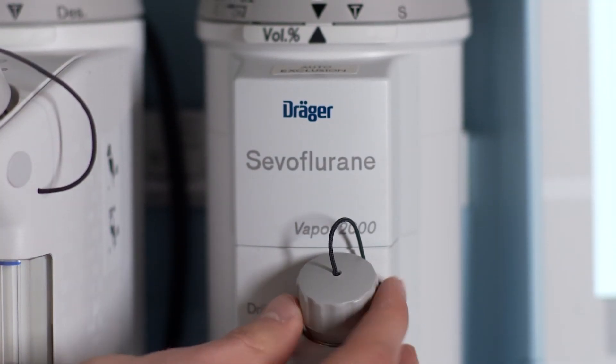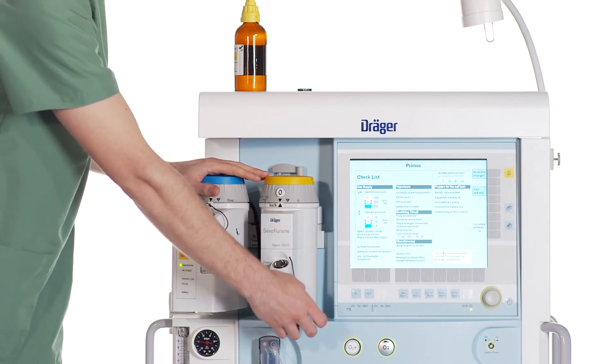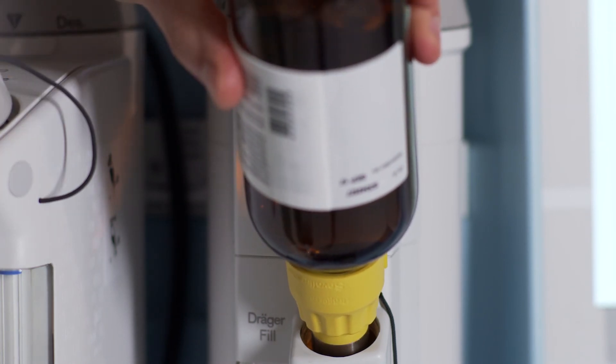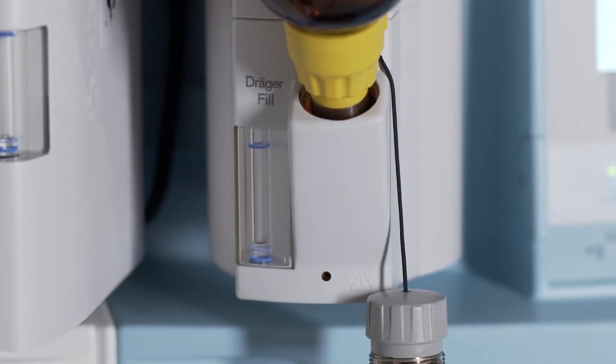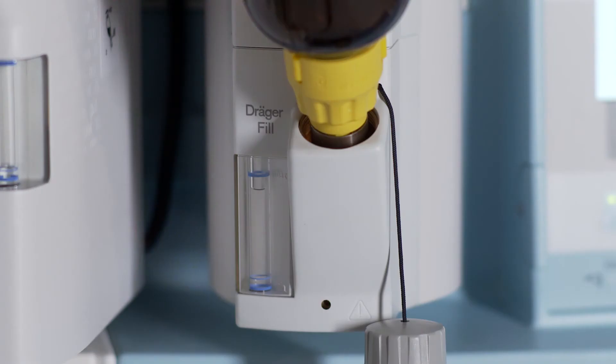Slowly unscrew the sealing cap from the Vapor 2000. Insert the bottle into the filling opening. Press the bottle down and keep it pressed down. The anaesthetic agent will flow into the Vapor. Please observe the sight glass and make sure not to fill the Vapor higher than the maximum mark.